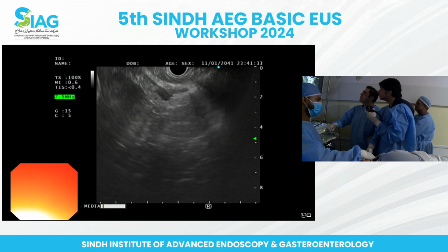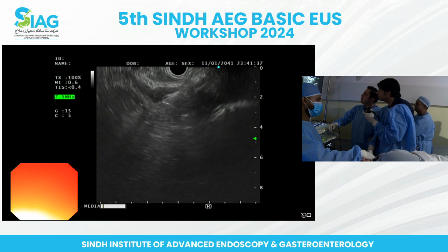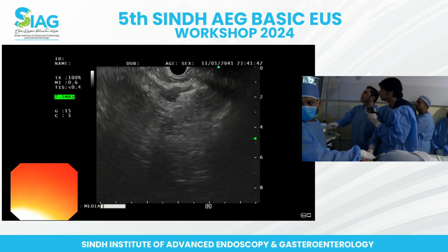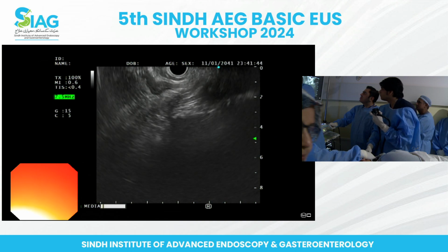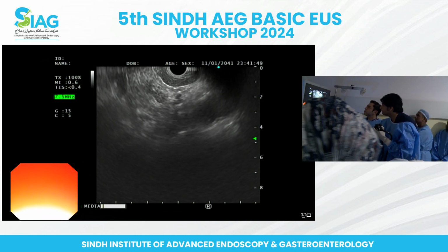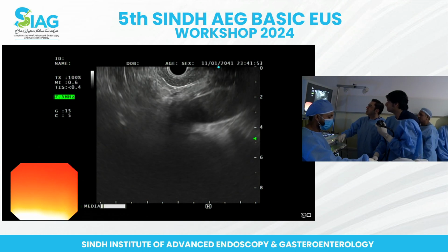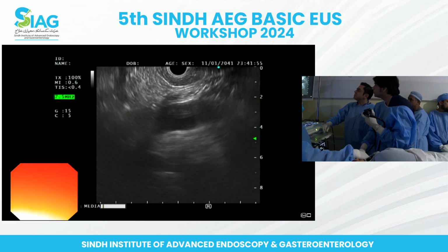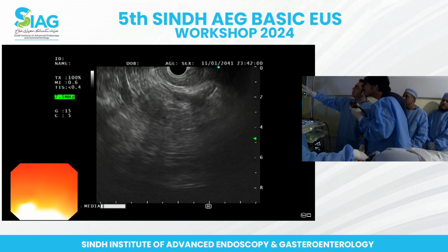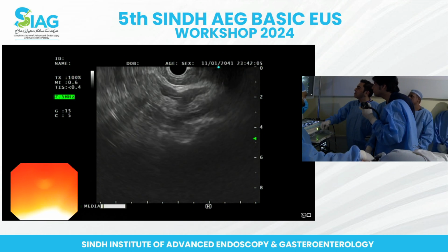Okay. So the pancreas is coming up here. If you put the aorta in the center and keep on pushing the scope in, you should be able to reach the pancreas, okay? So keep the aorta in view. Excellent. And now push. You can see the mass is coming up there as well, the thickening of the lining. We will come to that in a moment, but we're just first seeing the pancreas if we can. Yeah, so you saw the splenic vessel, I think it just whizzed past you.